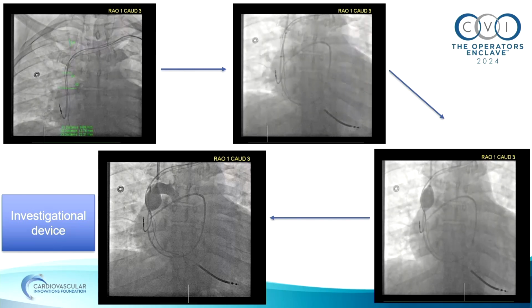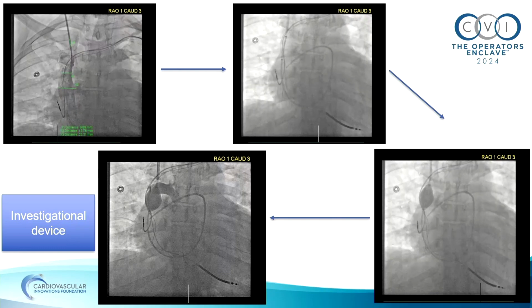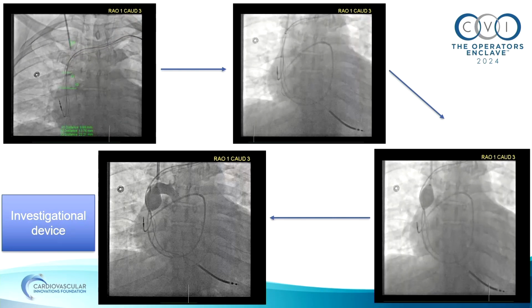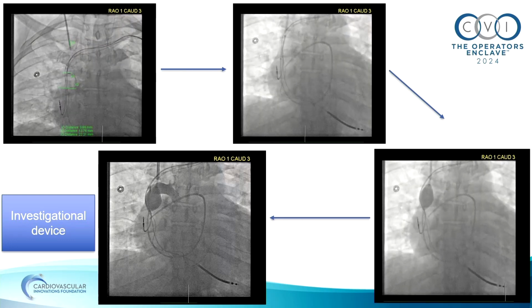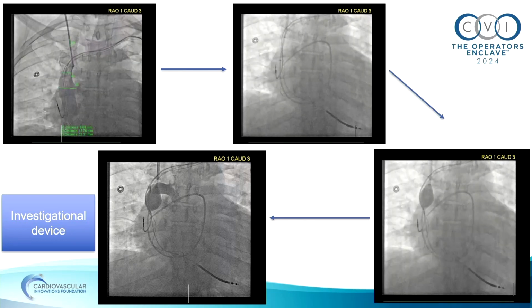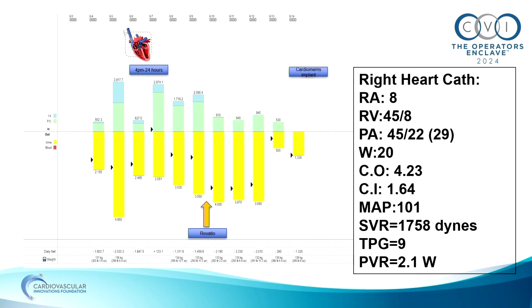The machine outside will have a screen that gives you the pressure proximal and distal to the balloon, so you create a gradient across that. Typically about 5 in the initial trial, we do up to 10 millimeters mercury of gradient. And then it essentially cycles, inflates, keeps inflated for about 10 minutes, if I remember right, and then you deflate for a few seconds and continues to inflate.